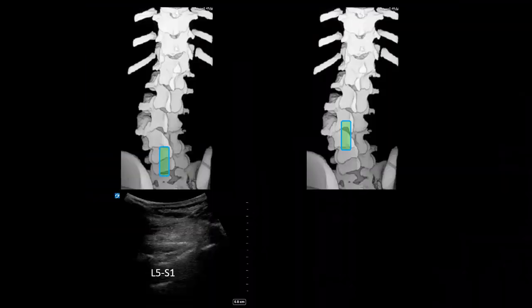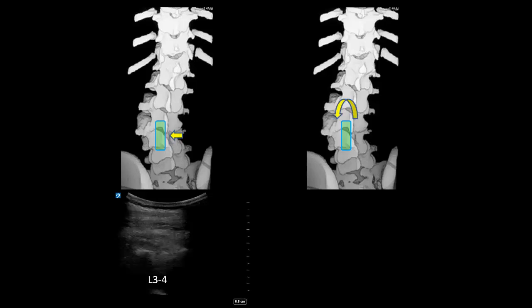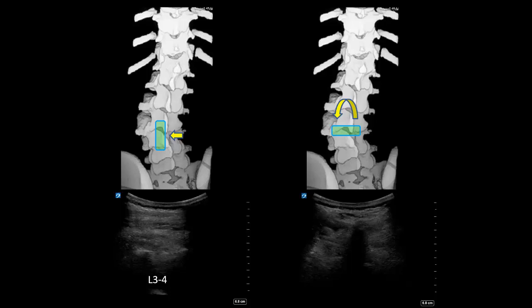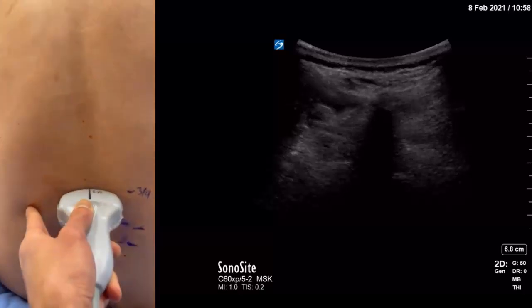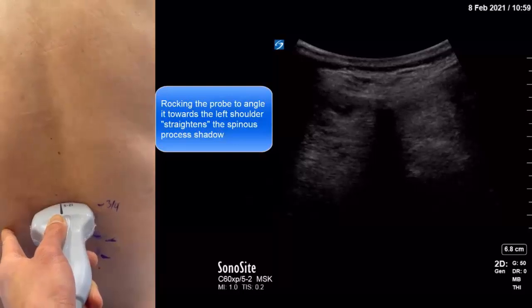Parasagittal imaging with the ultrasound has allowed us to independently confirm the presence of a lumbar scoliosis with a convex curve to the left. This is further verified by turning the probe transverse and visualizing the spinous process shadow, where we can see that the spinous process shadow is tilted and not perfectly vertical.